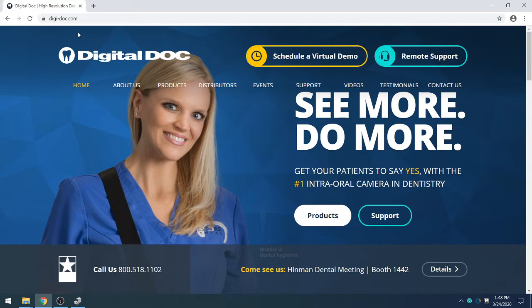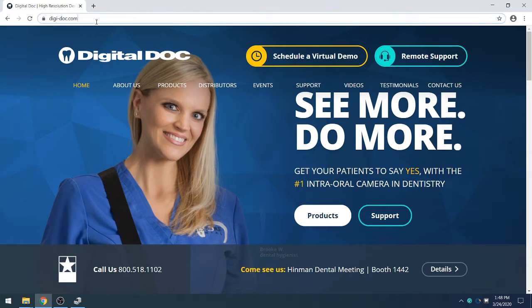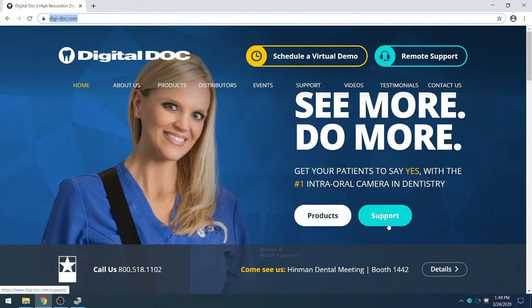First thing you're going to want to do is navigate to our website, which is www.digi-doc.com, and once on our homepage you will then select Support.